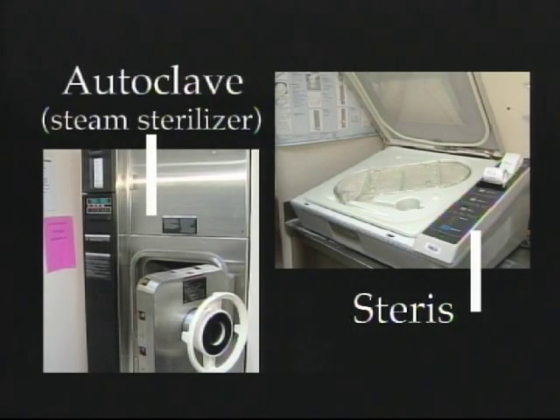Although the steam sterilizer and the Steris are located just outside the operating room in the sub-sterile area, they are vital pieces of equipment that merit mention here.